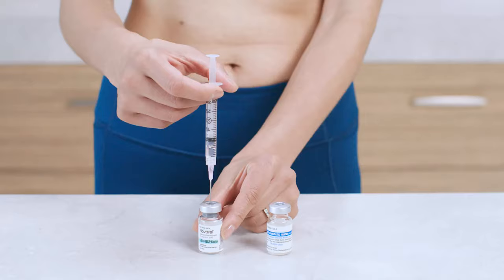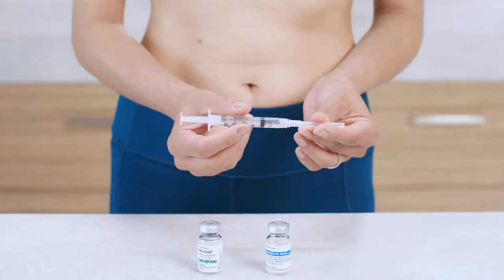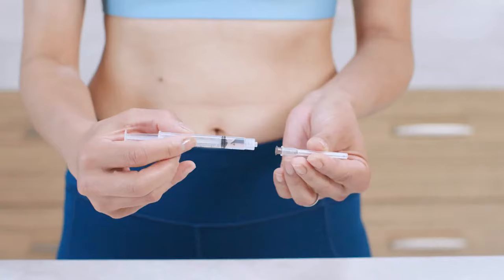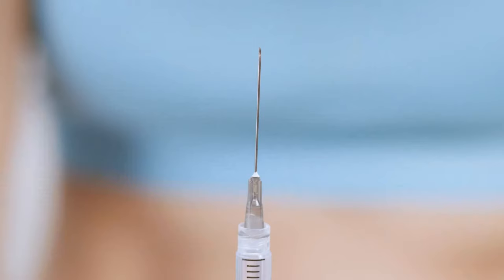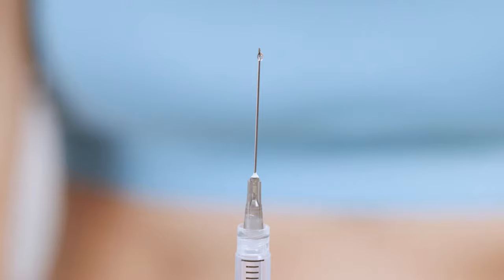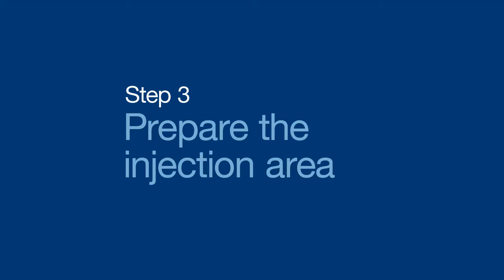Now you're ready to switch needles. First, remove the mixing needle, recap it, and twist off the needle and cap from the syringe. Toss both the vial and the needle into the sharps container. Next, twist the injection needle onto the syringe and remove the cap. Point the needle up and tap or flick the syringe to remove any air bubbles. Then press the plunger slightly until a tiny droplet of medication appears at the tip of the needle — a droplet is a good thing, it means your medication is ready to go. Recap the injection needle and set it aside.